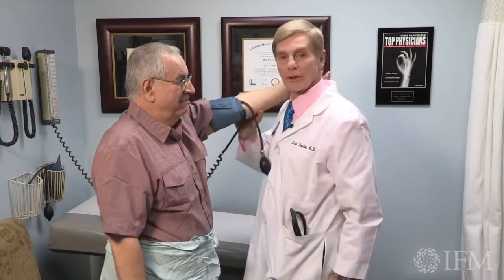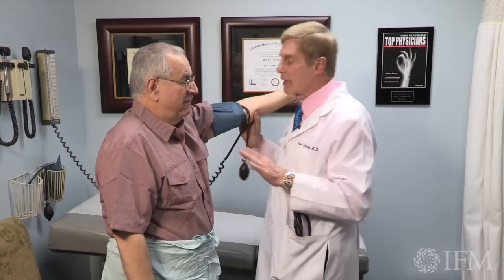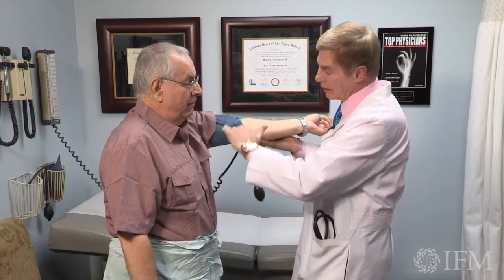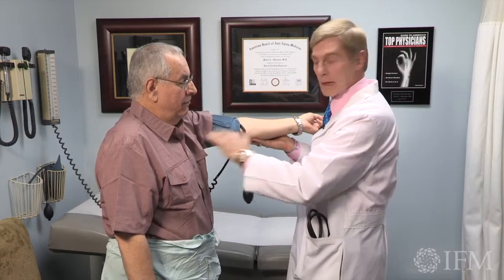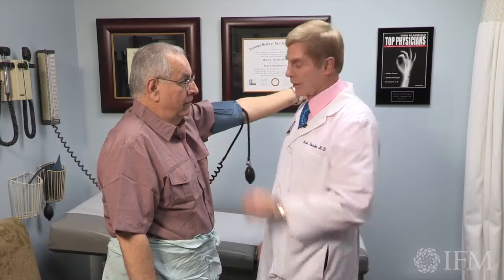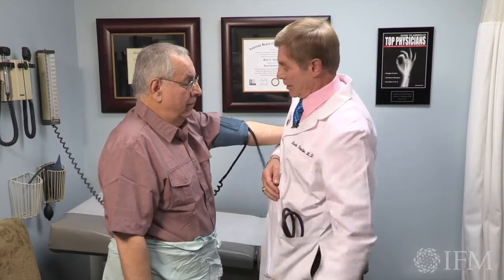If I've got a real short person, you may put it on your shoulder. Play around with it, but the key thing is to make sure that the arm is totally level with the heart and it is supported. So if I have a short person, you can see that's a little bit up for him, but if I lock it in here, I'm good.